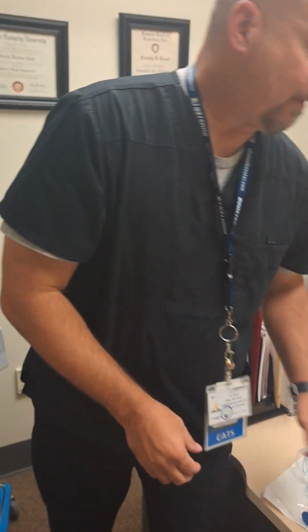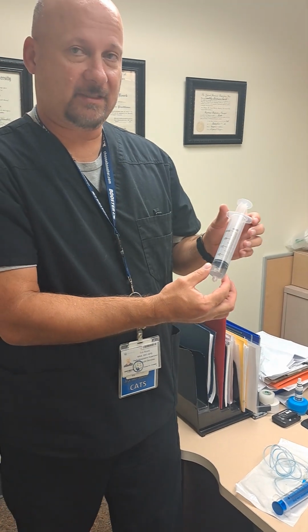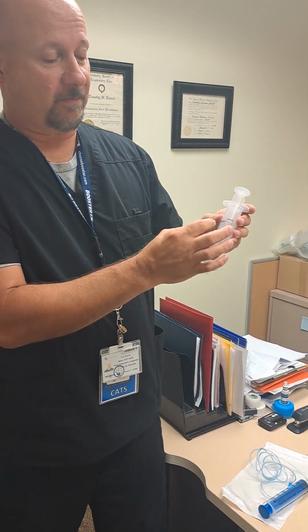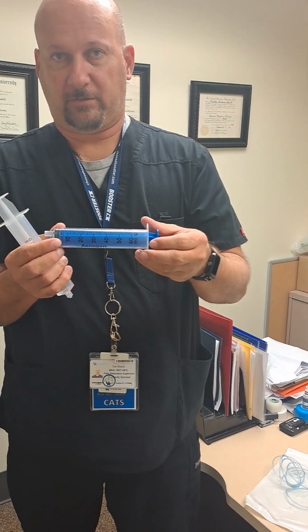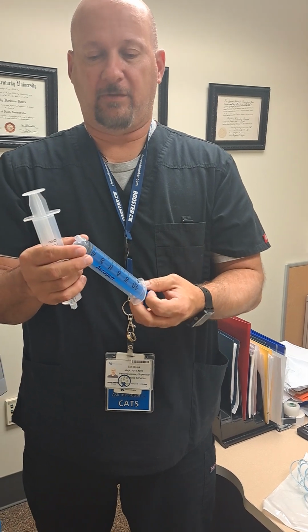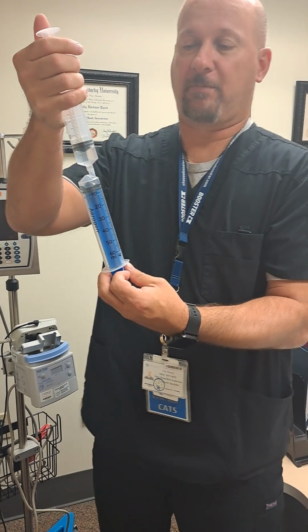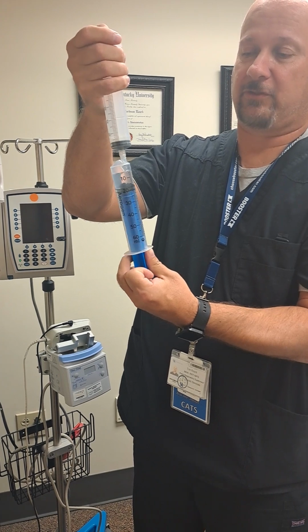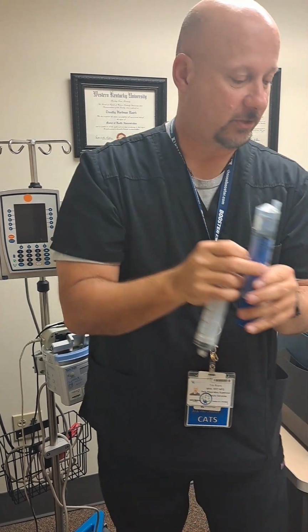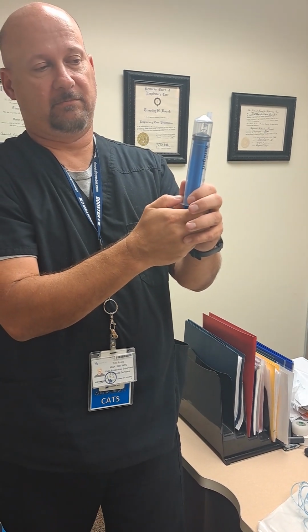So when the continuous albuterol is ordered, the pharmacy will prepare it. And we will get it in a syringe something like this. The albuterol will need to be transferred from this syringe to our Aerogen syringe. Okay. To do that, I pull back on the Aerogen syringe just a little bit. And as I'm pushing the albuterol in, sometimes you have to pull back on the plunger of the Aerogen syringe. So now we've got the albuterol transferred over. We'll get some of the air out of the top of it.